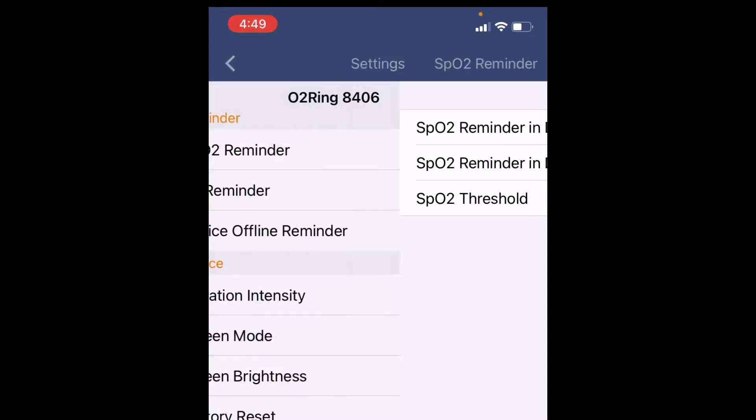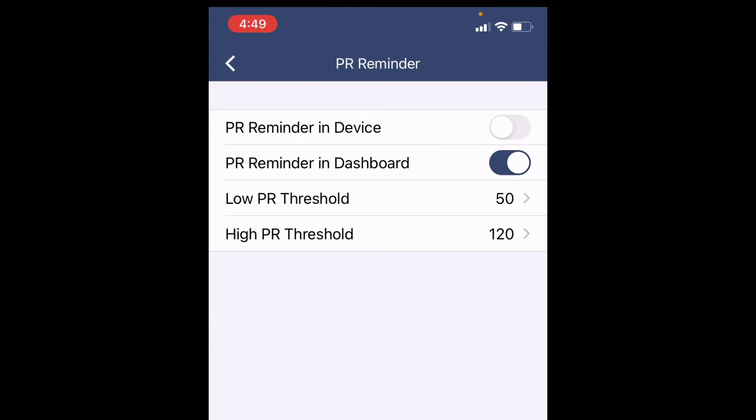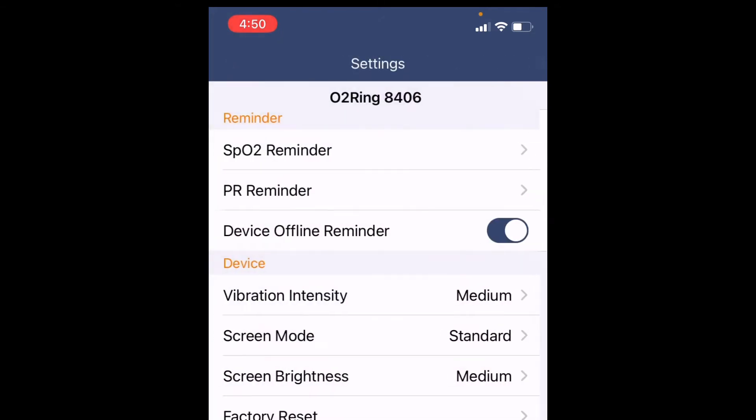For pulse rate, it's set low at 50 and high at 120. I'm going to change the high to 105 because I don't want my pulse going over 100. Sometimes you can have a nightmare or an active dream and your pulse might go up a couple of times — you don't want that to become a persistent pattern.